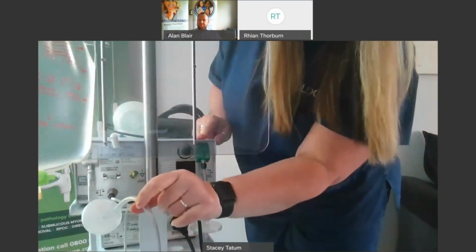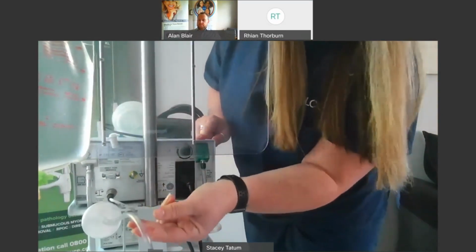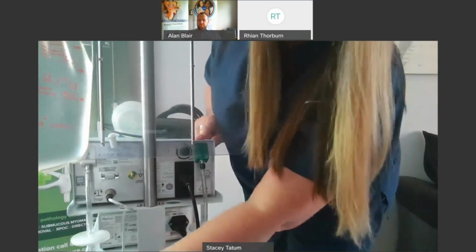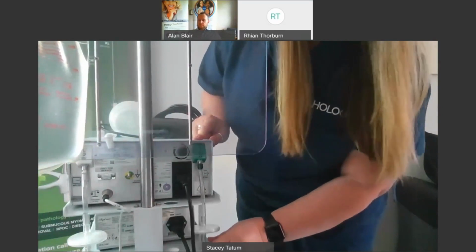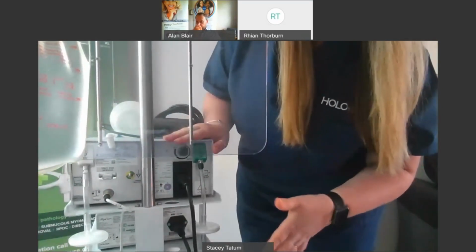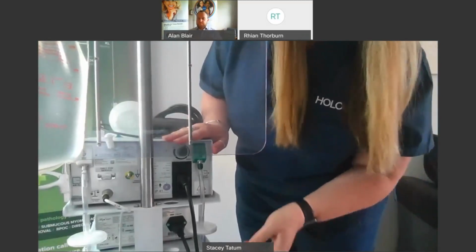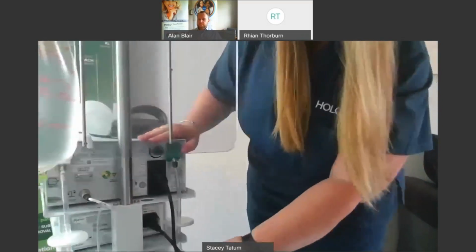I would check my reusable tubing. These, just lift the filters up, make sure there's no fluid in there, there's no condensation, there's one on each side. If there was to be fluid or condensation in there, you would need to change them straight away. If you try to put the machine on whilst they had fluid in there, it would cut out. So it's always worth having a spare set of these on your shelves.